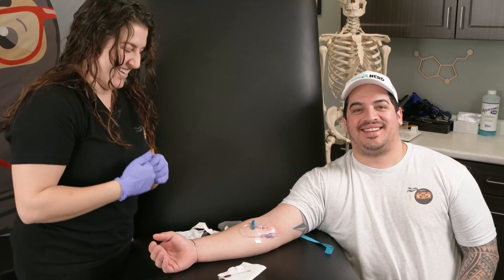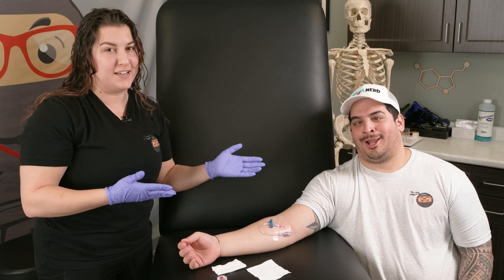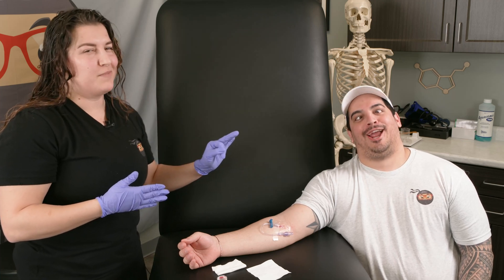And that is it — IV's in! All right Ninja Nerds, so Zach has his IV. He's gotten his medication and he's feeling a lot better.